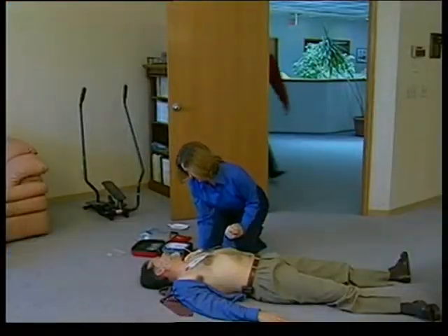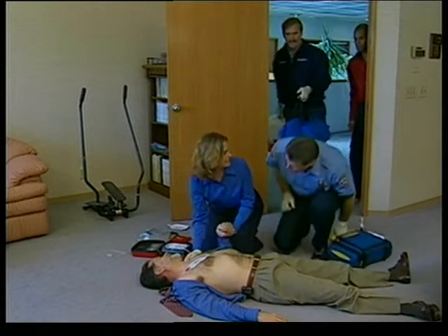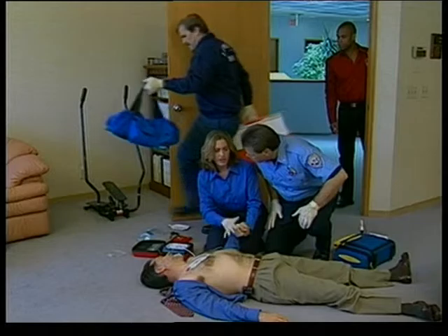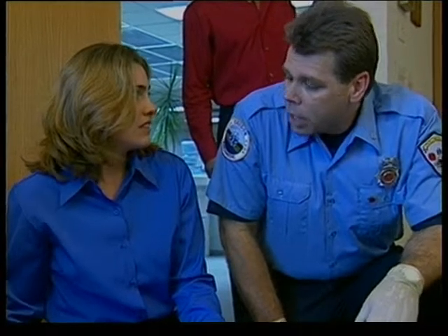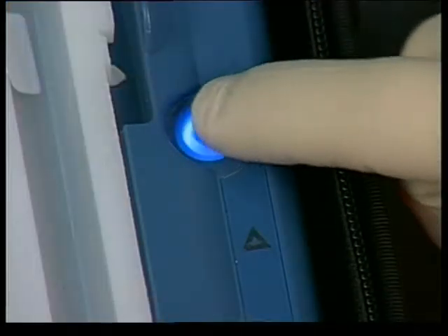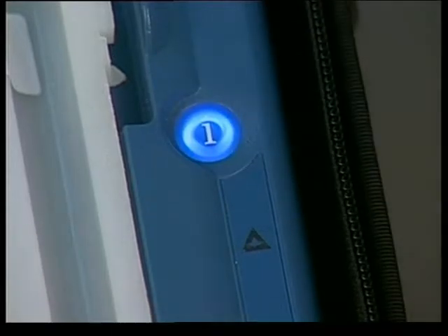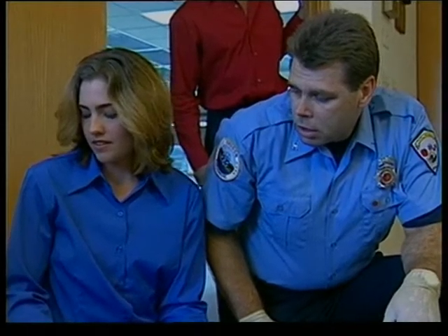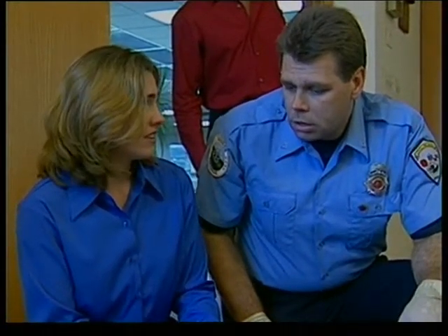Armando? Okay, just relax. Okay? He's right here. It's gonna be all right. Hi, can you tell me what happened? Yeah, we walked in here and he just dropped to his knees and then he just fell down. He was unresponsive. There's more information if you press the blue button. Okay, great. Let's do that. Okay. One shock, 7 minutes. So did you do CPR? Yeah, I did CPR before I got the defibrillator. Okay, good. Good job.